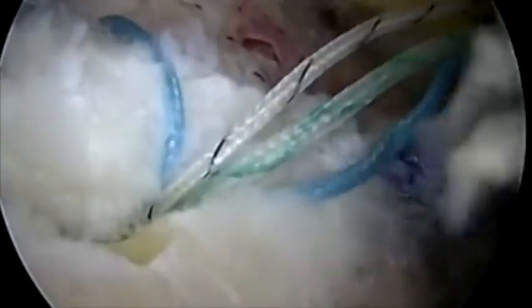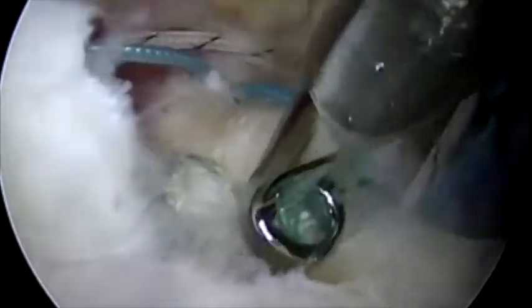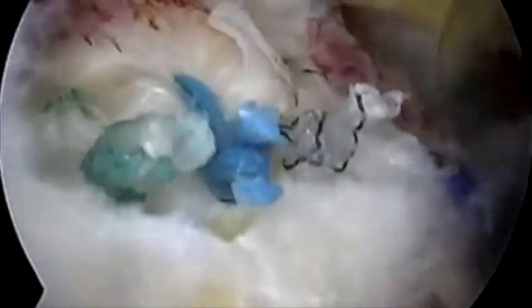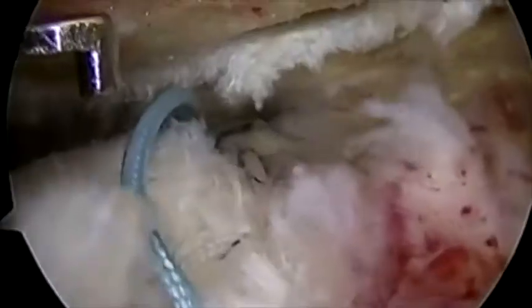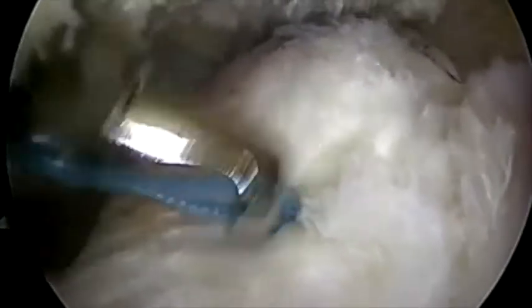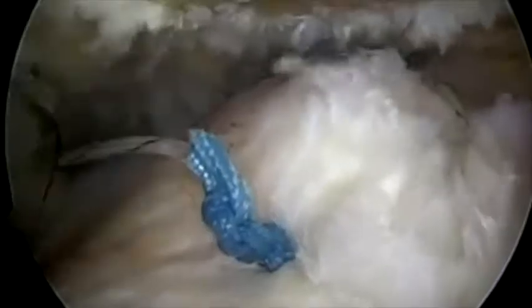The tear appears anatomically reduced. All subsequent sutures will then be tied again using a non-sliding knot. The final anterior suture is tied and the suture is cut. The tear appears well reduced and under little tension. The tension is then redirected to the posterior anchor and sutures, and the lateral suture limb is utilized for the post of both knots.